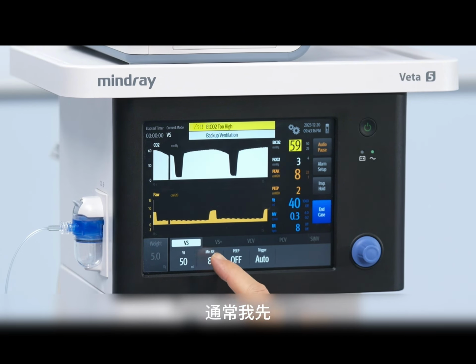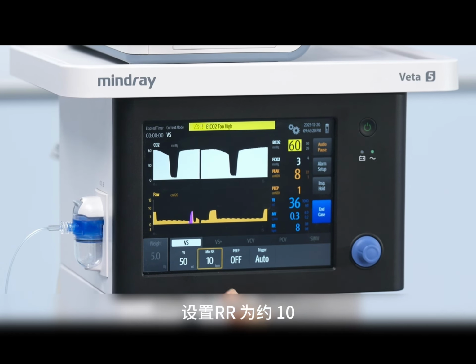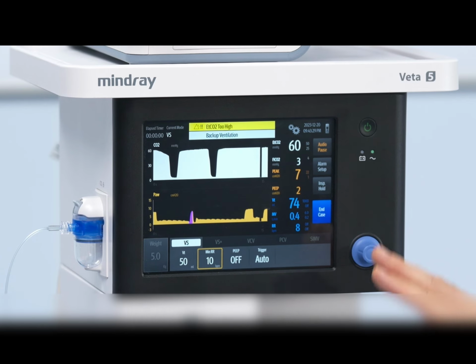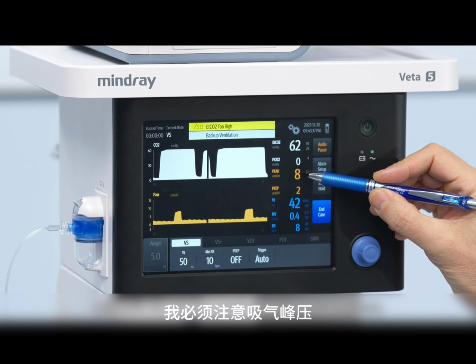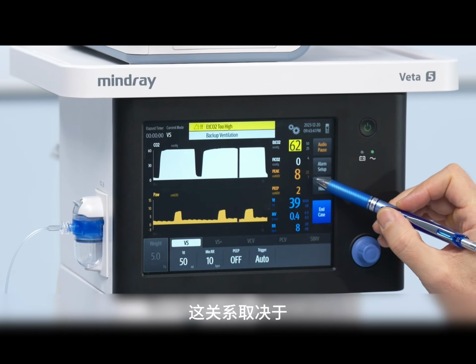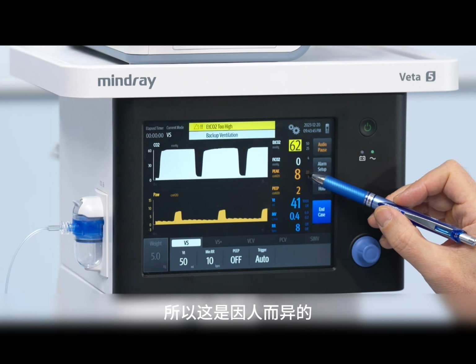Normally, I start with setting the respiratory rate to about 10, and then I increase the tidal volume step by step. Therefore, I increase the minute volume and hopefully decrease the end-tidal CO2. When I'm increasing the tidal volume, I have to be mindful about the peak inspiratory pressure. The relationship depends on the compliance of the chest of each patient, so it's individual.